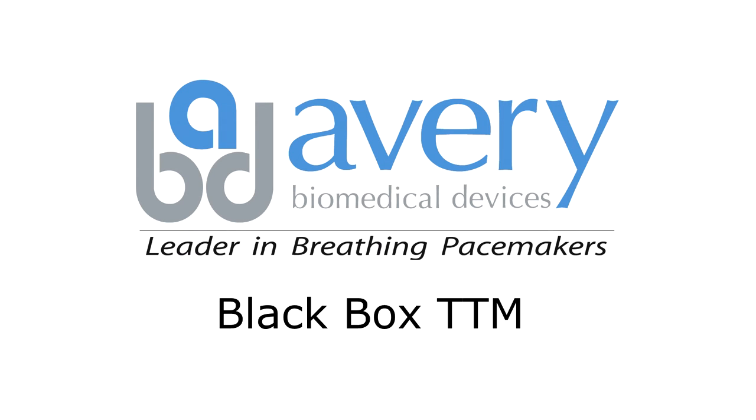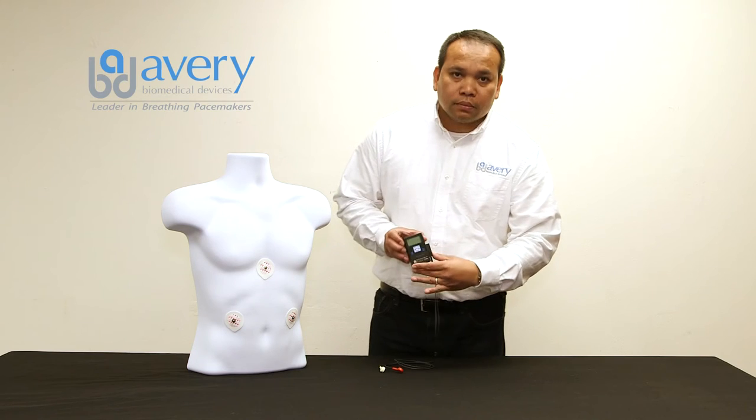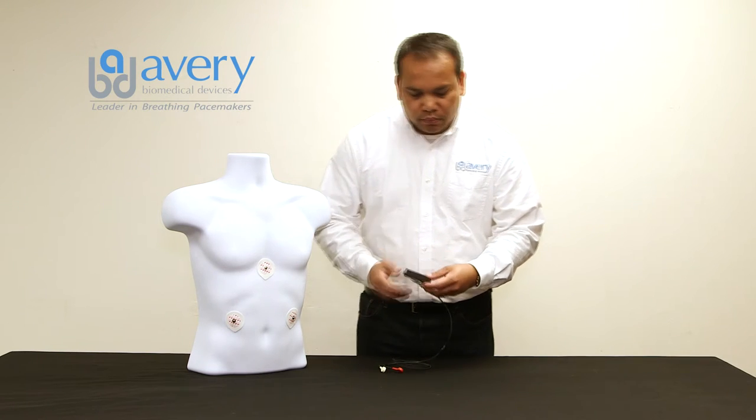Hi, and welcome to the Avery Biomedical Devices Transtelephonic Monitoring instructional video. In this video, we will demonstrate how to record and transmit a TTM. We will be using a black box TTM, also known as model ER920AF.